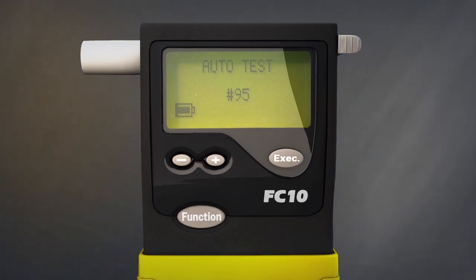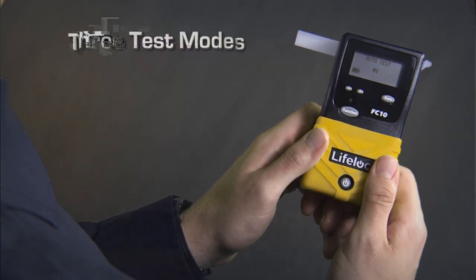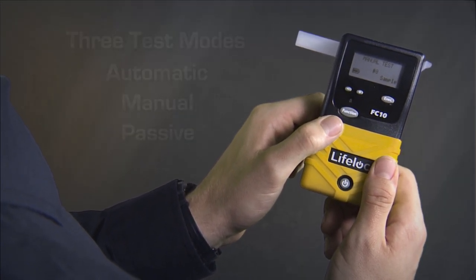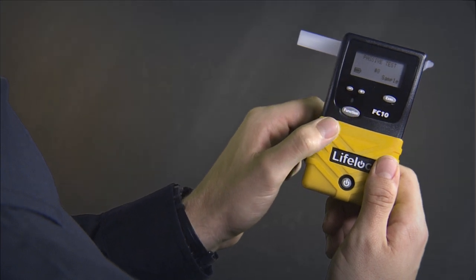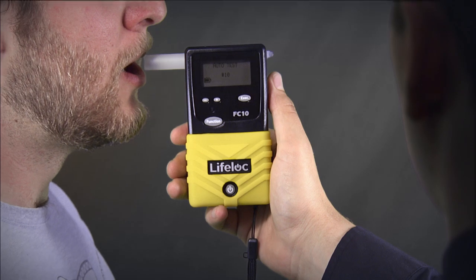Every FC model comes standard with three sampling modes to accommodate any testing situation: automatic, manual, and passive. Auto testing makes breath alcohol testing so easy it's virtually impossible to make a testing error. In auto mode, the breathalyzer automatically triggers a breath test as soon as the device captures the correct volume of breath.